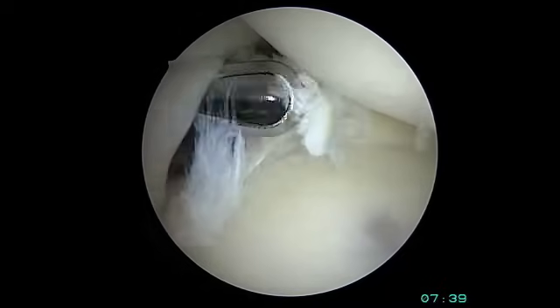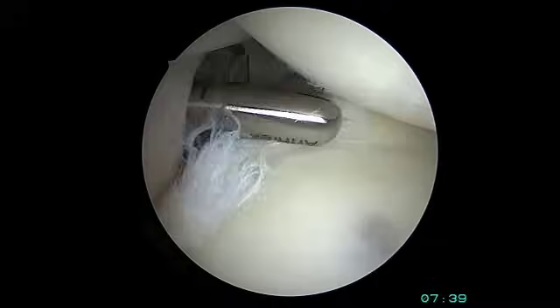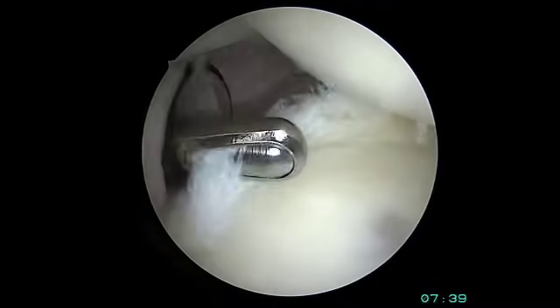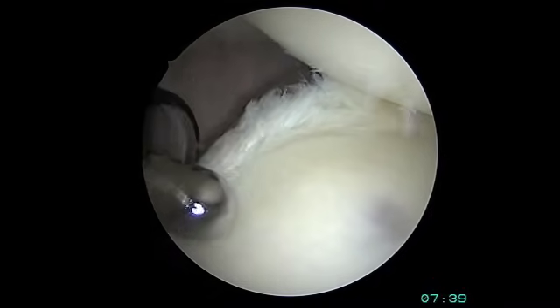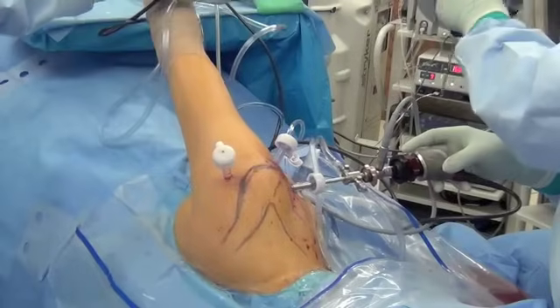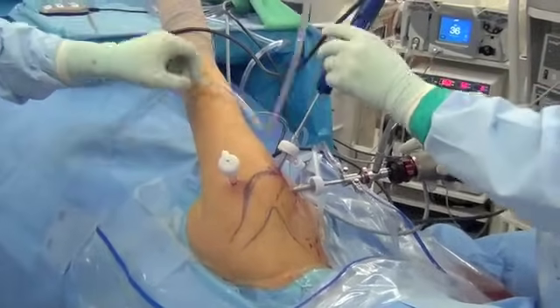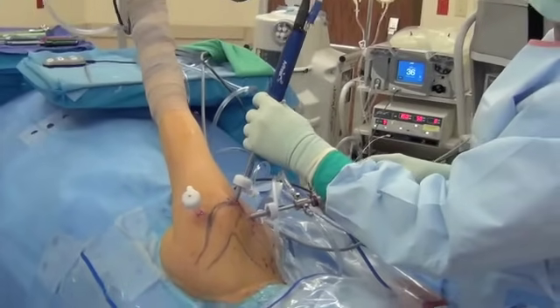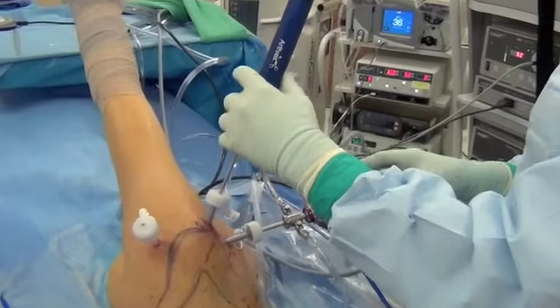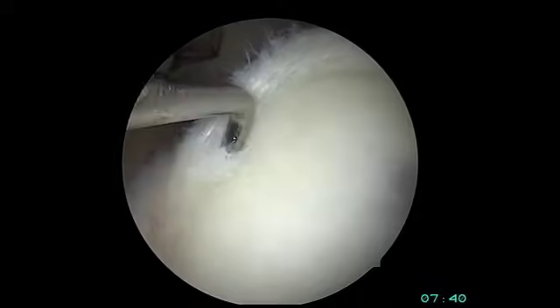This shaver instrument will gently remove and suction away the frayed portion of the labrum. All of this procedure is done with the patient on their side in the lateral decubitus position, through three small plastic cannulas that keep water in the joint. This is all done under water. The shaver instrument goes in one cannula and the arthroscope in the other.